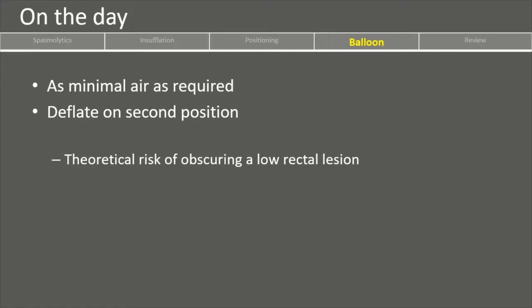With regards to the balloon, ultimately you just need to use as minimal air as possible to ensure continence. Younger patients don't need much air in the balloon, more elderly patients might need a bit more. But if you are inflating the balloon, you do ensure to deflate it on the second position, as there is a theoretical risk of obscuring low rectal lesions.